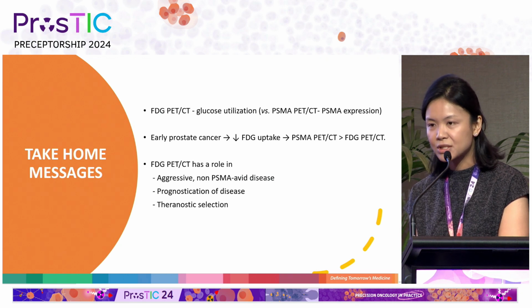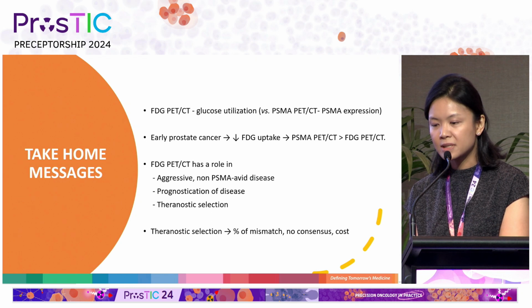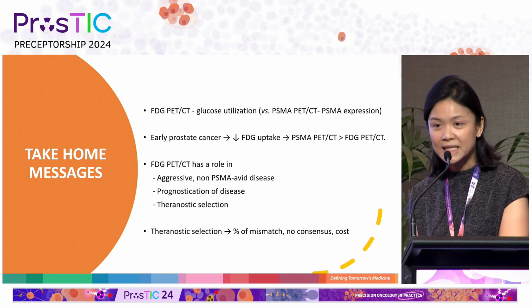So for better selection of patients for treatment, as well as for those patients who are treated, it can serve as a prognostic biomarker. For theranostic selection, I think there's still some areas to be fine-tuned to completely justify the cost of an additional scan.